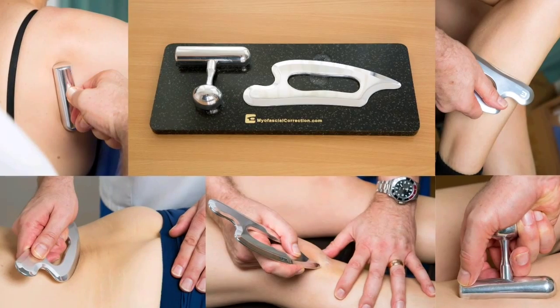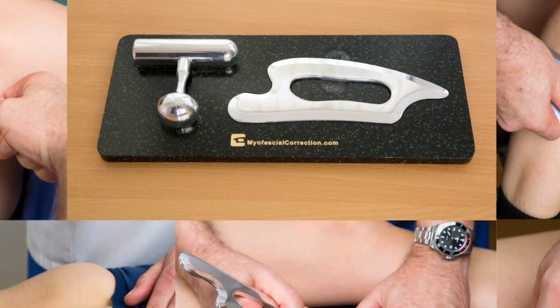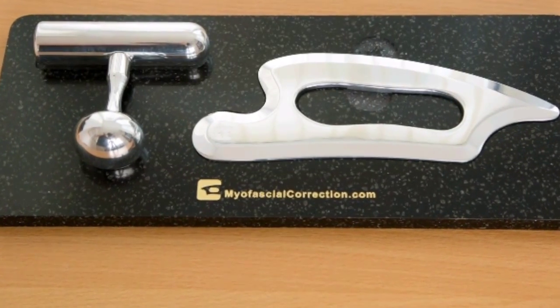Our instruments are ergonomically designed, their function deciding their form — they are precision engineered and hand finished. Looking at the videos, you'll see how effective and simple these instruments are to use.